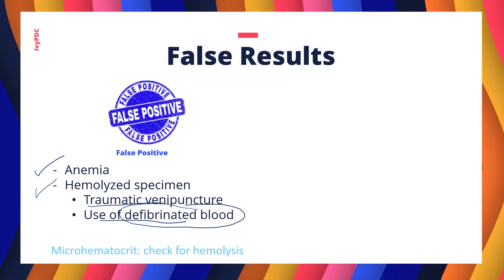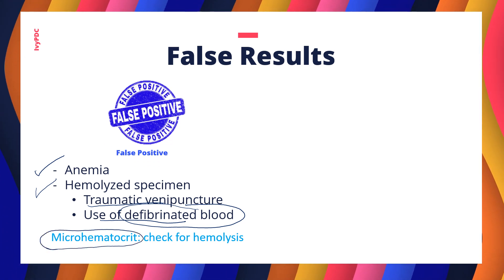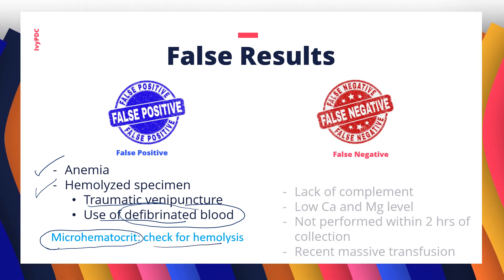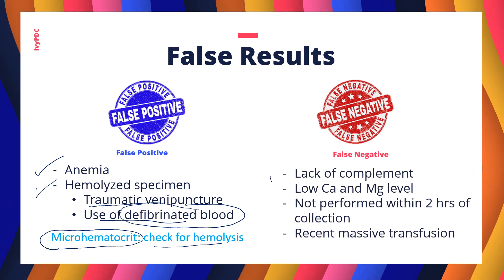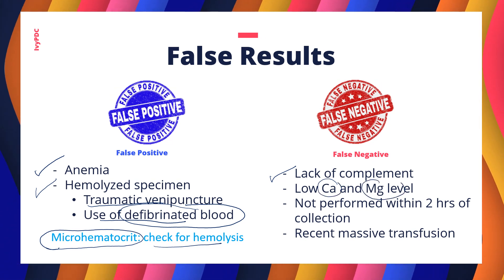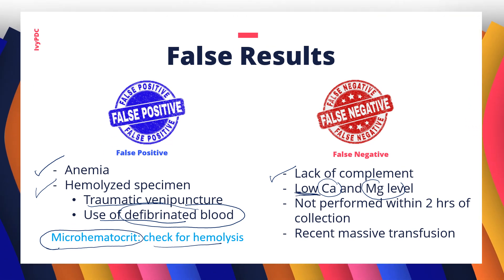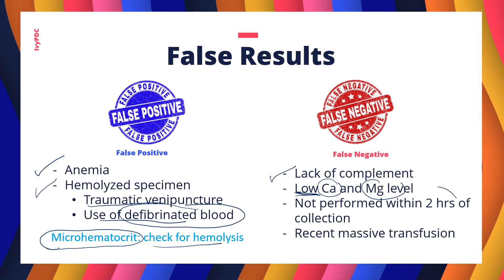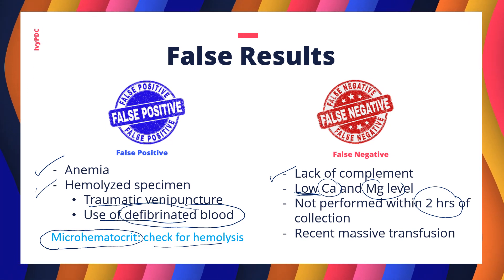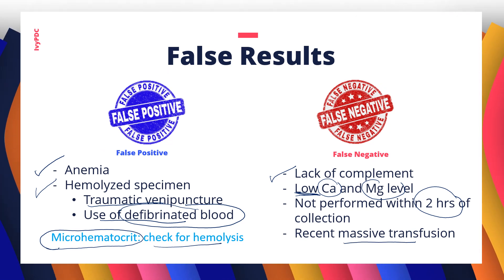It is recommended that before testing, a small portion of the specimen be centrifuged to check for pre-existing hemolysis. For false negatives, one cause is a lack of complement in the patient's plasma — calcium and magnesium are ions used in complement-mediated hemolysis, so low levels cause false negatives. The test should also be performed within two hours to avoid false negatives. Additionally, blood transfusion can dilute the percentage of PNH cells, resulting in a false negative result.